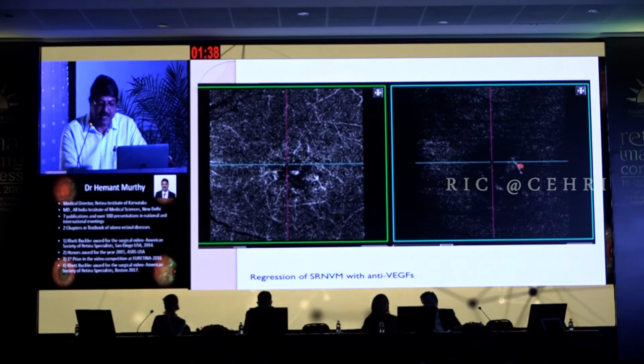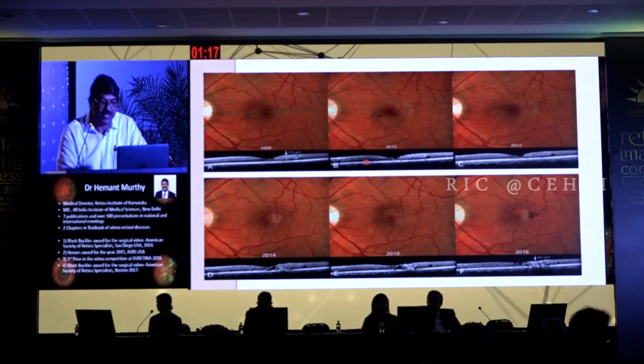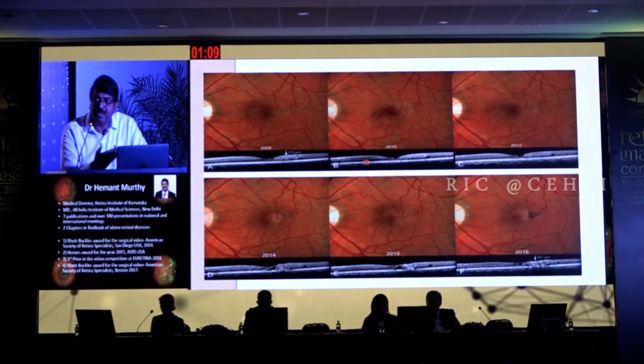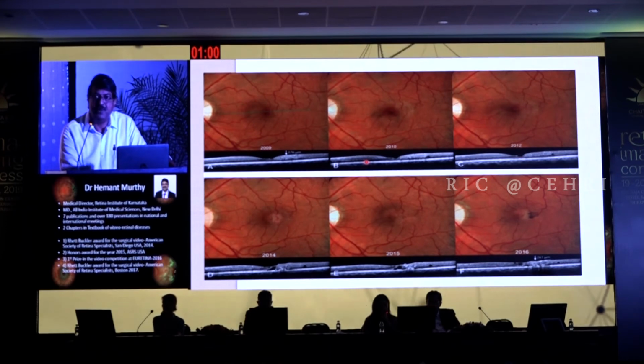This is a study by Richard Spaide, which looked into a patient from 2009 to 2016, and shows the various stages that they have gone through, starting with the loss of the Muller cells, with the collapse of the tissue, and the loss of the ellipsoid zone in the non-central area, which starts progressing towards the center. There is tissue contraction in the temporal part of the macula, and that leads to a change in the architecture. There is a lot of contraction of all the blood vessels. There's a right-angled venule, which then leads to the neovascular process starting superficially and going deeper.